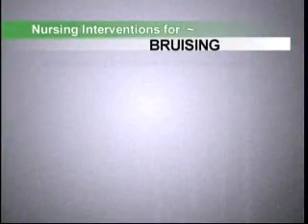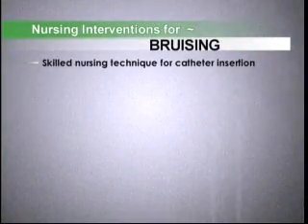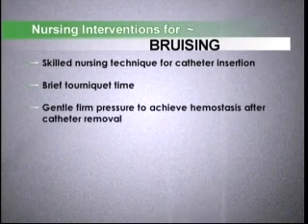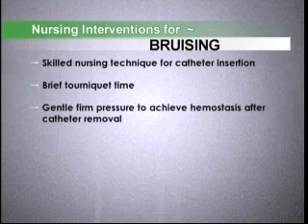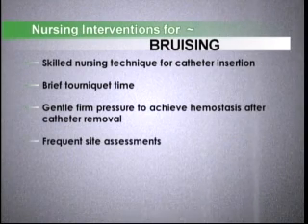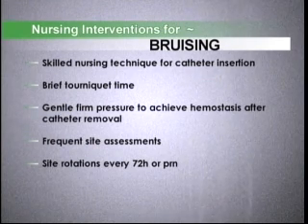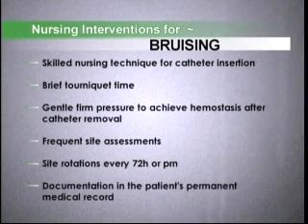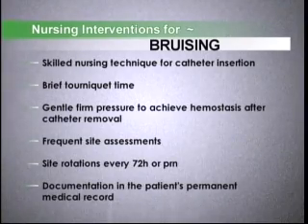Now, let's take a look at some nursing interventions of the previously mentioned complications associated with infusion therapies. Bruising. Skilled nursing technique for catheter insertion. Brief tourniquet time. Gentle, firm pressure to achieve hemostasis after catheter removal. Perform frequent site assessments. Site rotations every 72 hours or PRN. And documentation in the patient's permanent medical record.